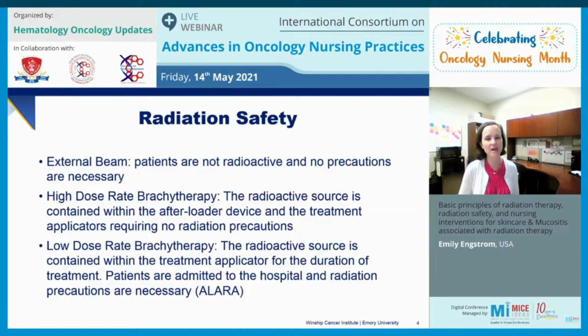Now we almost exclusively use high dose rate brachytherapy. This allows us to place applicators where we need those radioactive seeds to go, and then we're able to place the patient in a safe room, connect them through transfer tubes from those applicators to what's called an afterloader machine. Then we come out, close the door, and the system sends those radioactive seeds into the applicator as we prescribe for the different times of dwelling in the applicator to receive the proper dose of radiation.